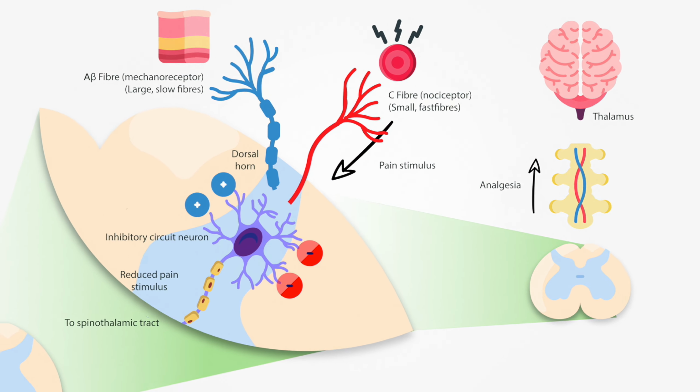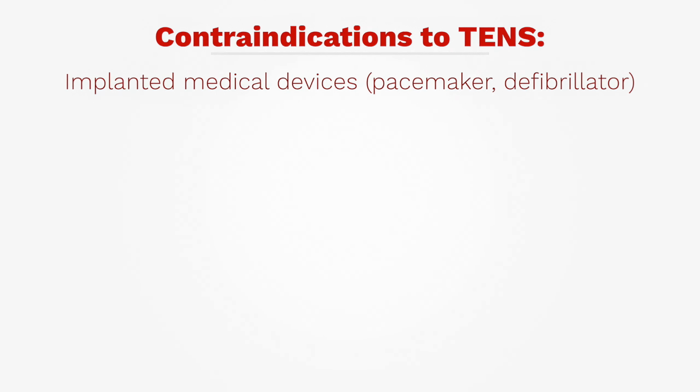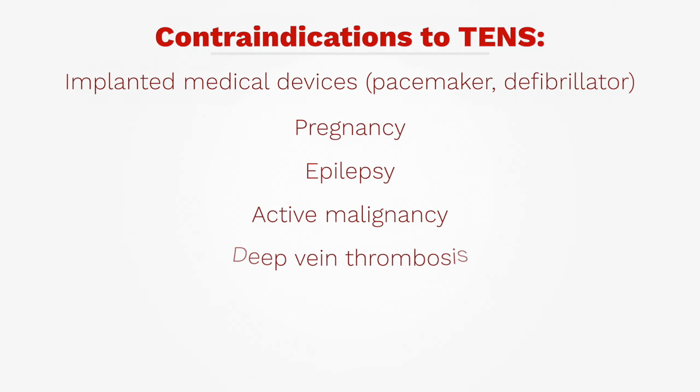Whether it's actually working for pain relief is the subject of contention, and I'll be discussing some of the research around TENS later, but it's important to note that TENS should not be administered to people who have implanted electronic medical devices, including pacemakers and defibrillators, and caution should also be taken before using TENS in those who are pregnant, have epilepsy, active malignancy, deep vein thrombosis, damaged skin, or who are frail.